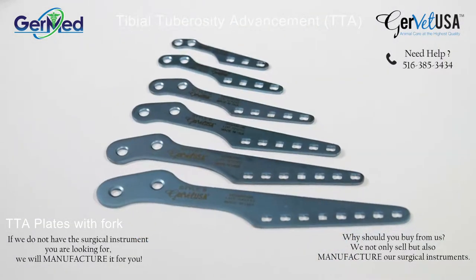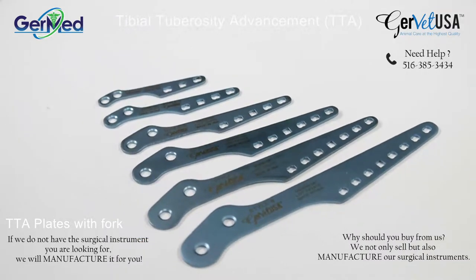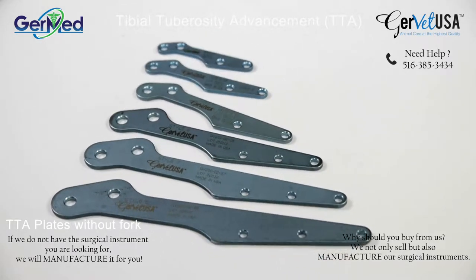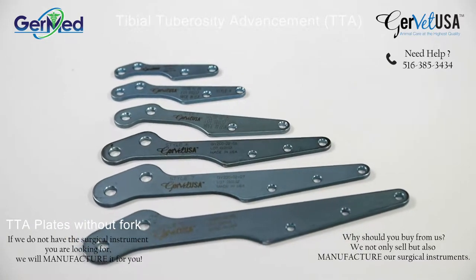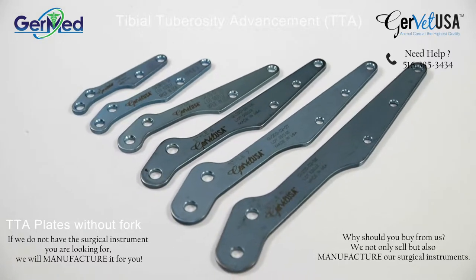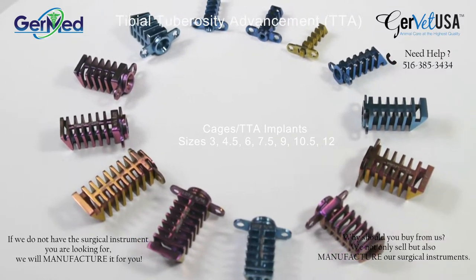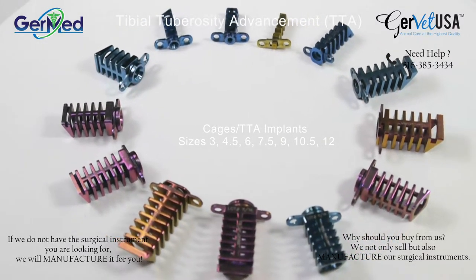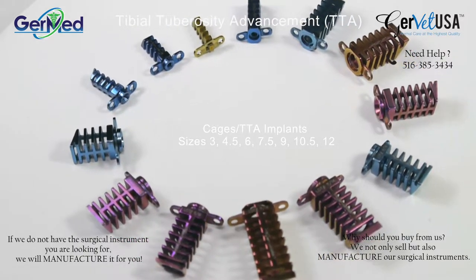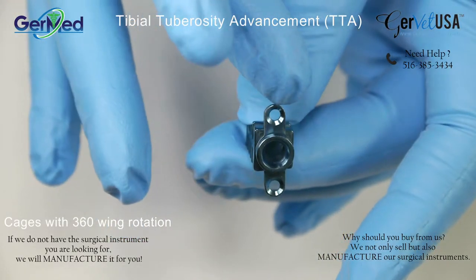There are two systems when it comes to TTA. The first one is a plate with a fork, and the second is a plate without a fork, in which screws are used instead. The screws and cages come in a variety of lengths and sizes. The cage sizes are 3, 4.5, 6, 7.5, 9, 10.5, and 12 millimeters. All cages rotate 360 degrees.